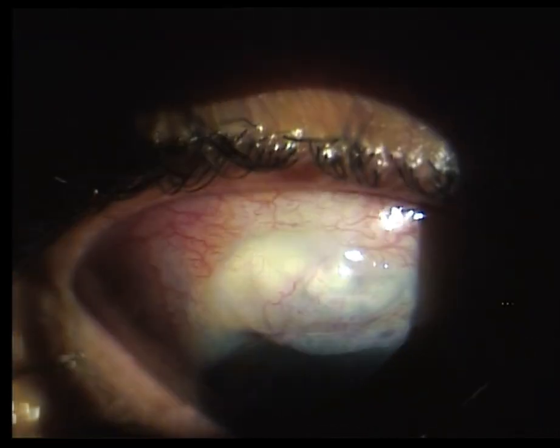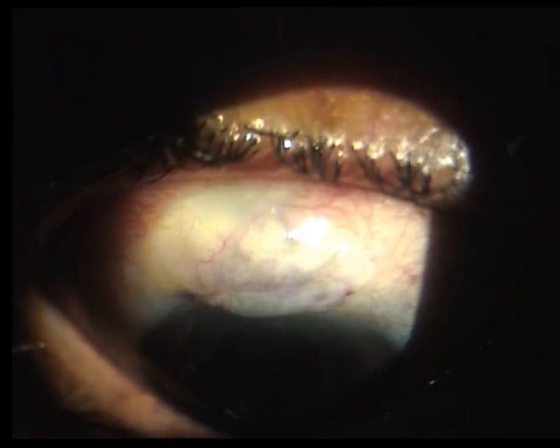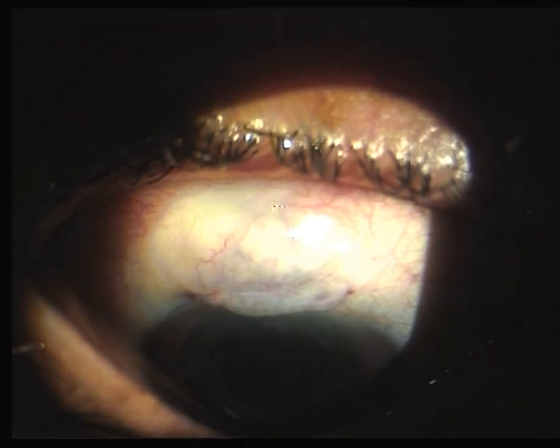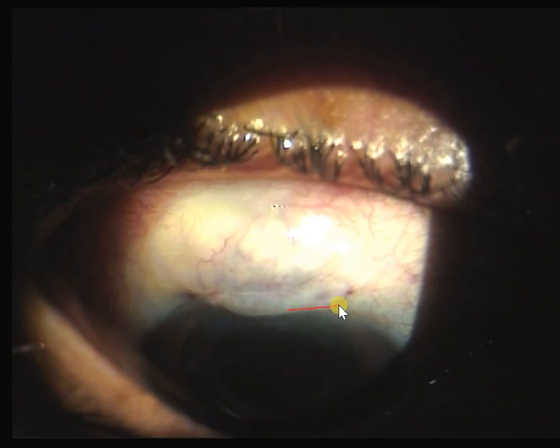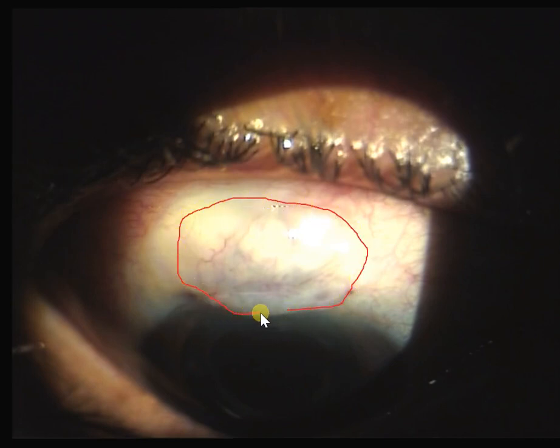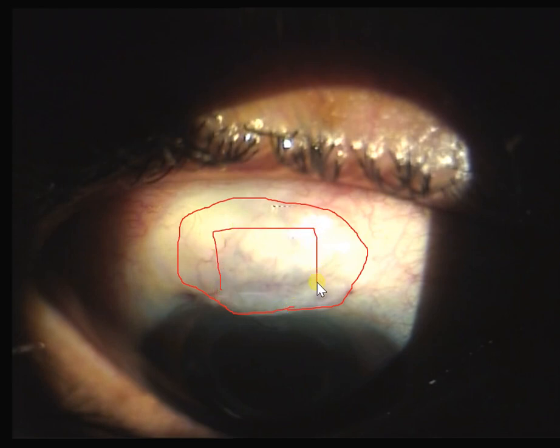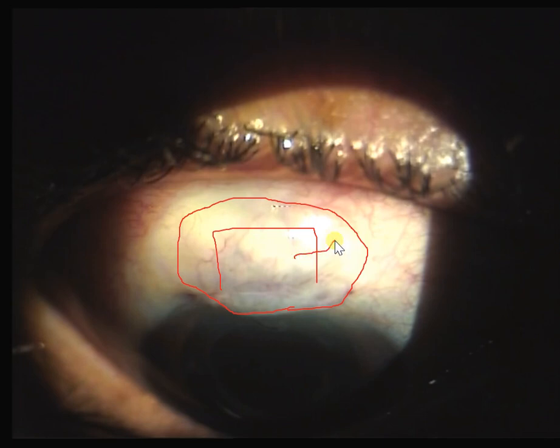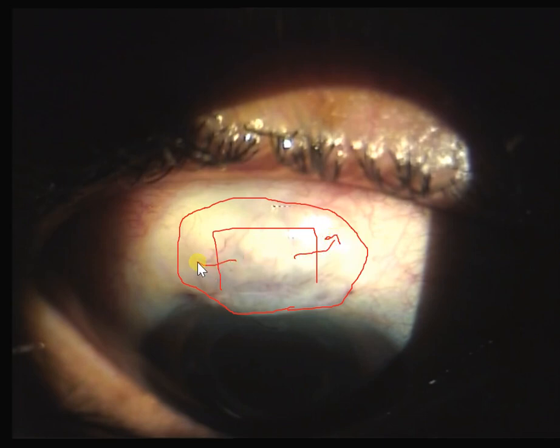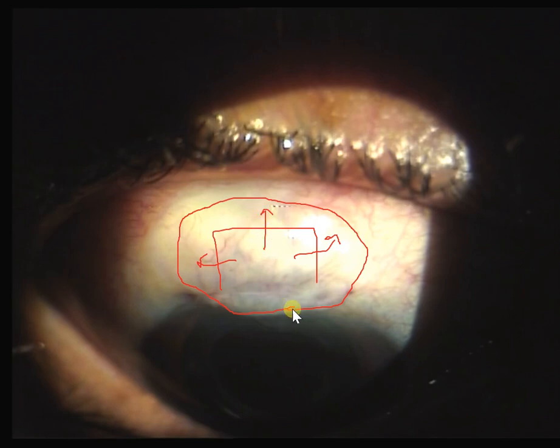Here we'll show you a glaucoma bleb. This is a typical glaucoma bleb - you can see the outline of the bleb, and this is a cystic bleb. This is the bleb and this is the trap door which you see beneath it. The flow of the glaucoma bleb is supposed to go from this side and spread in three directions.